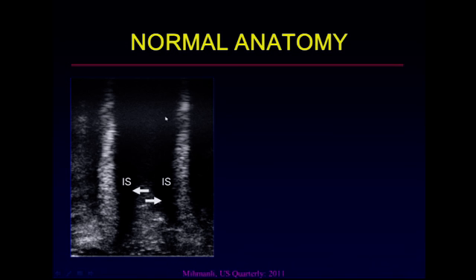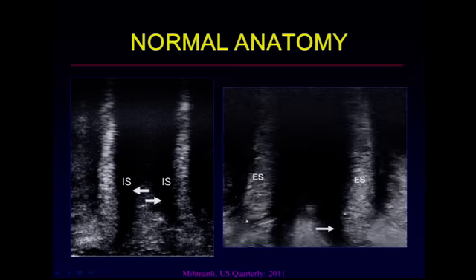And outside of that, more peripheral, will be the echogenic external sphincter. And as you can see, it extends further south, if you will, than the bottom of the internal sphincter. And here you can see a further depiction showing that the external sphincter extends a little bit more inferiorly than the internal anal sphincter.